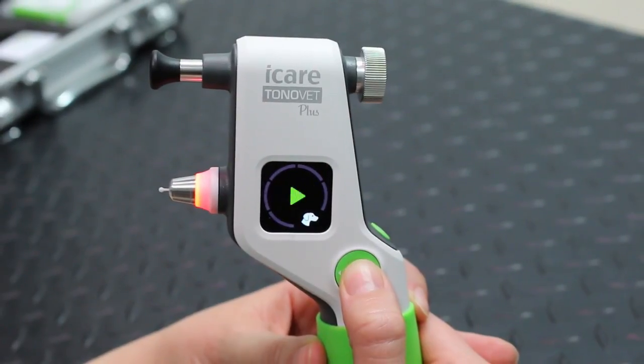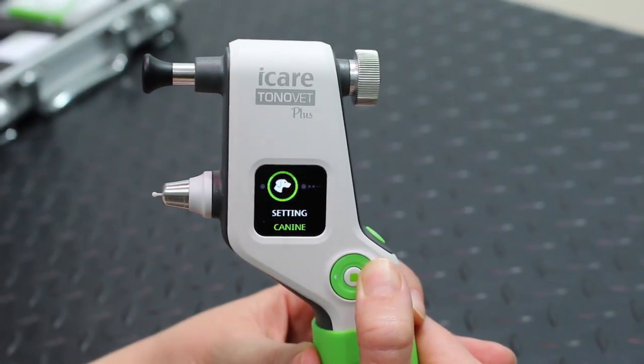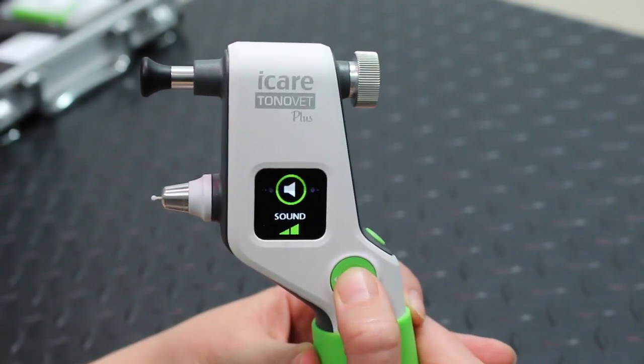If the lights or beeps are upsetting your patient, you can actually turn them off simply by scrolling through the menu.